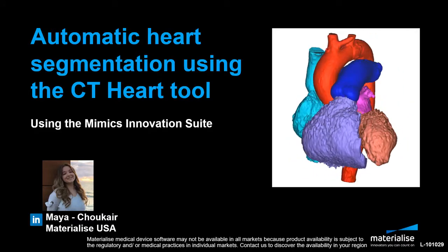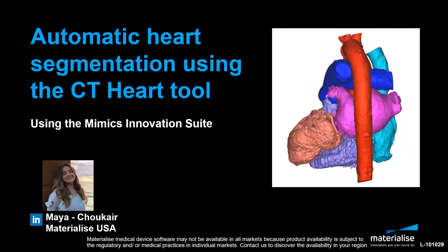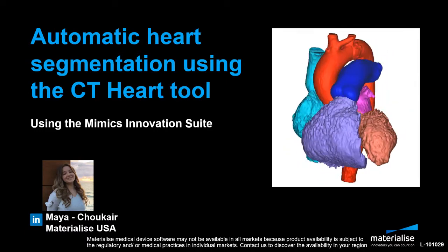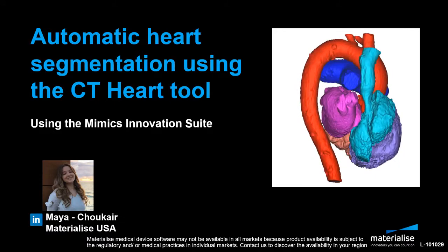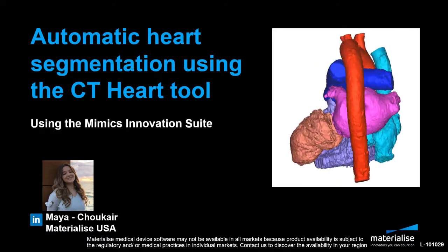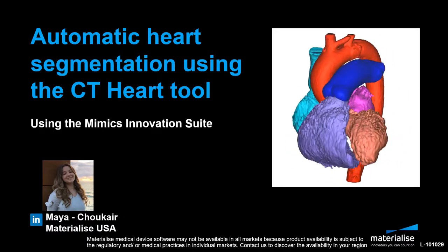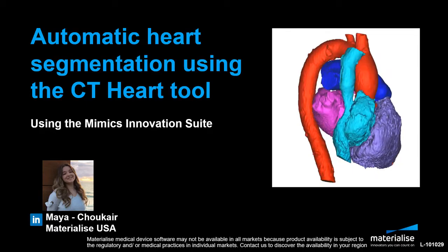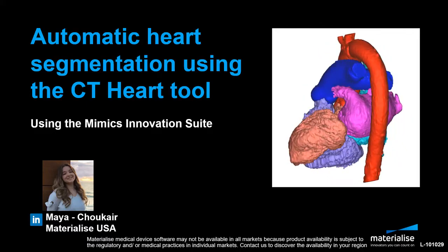Using the CT heart tool in Mimics will hopefully help you increase your productivity, leaving you more time for analysis, design, 3D printing, or whatever you typically do in your workflow after segmentation.